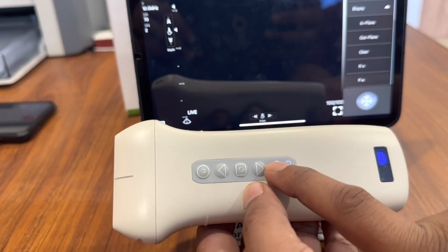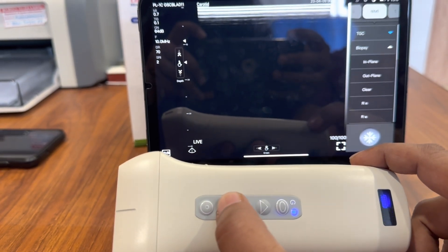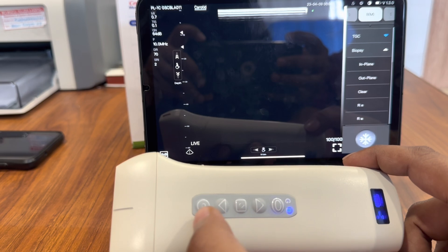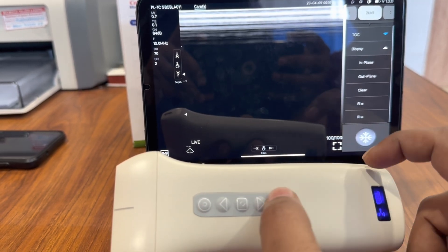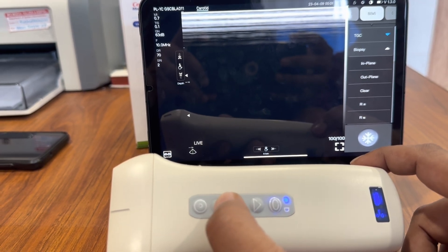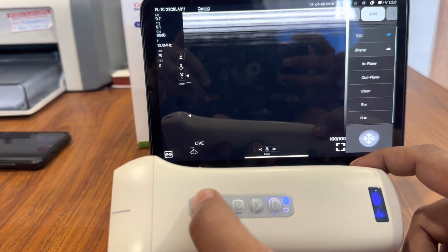On the device we have five buttons. The first button lets you toggle between gain and depth — you can increase or decrease the depth, or increase or decrease the gain. You can also freeze and unfreeze with the probe button.